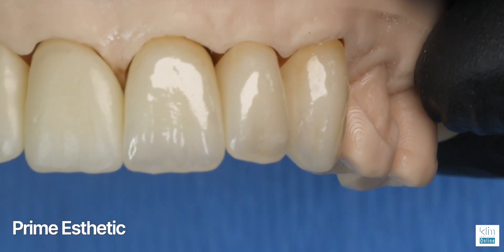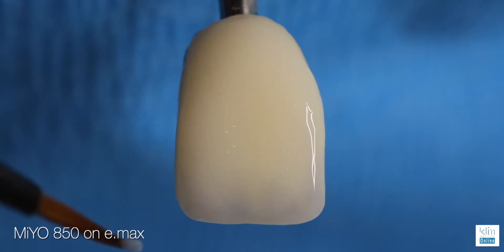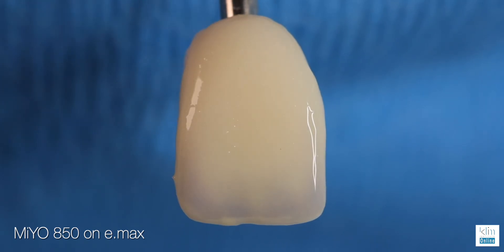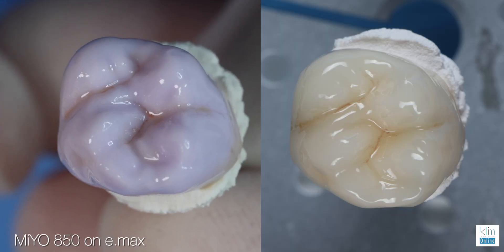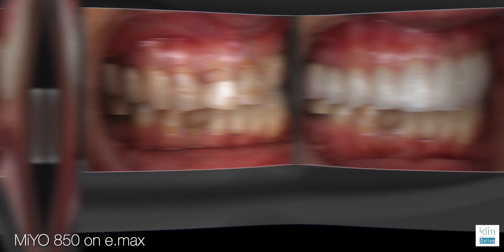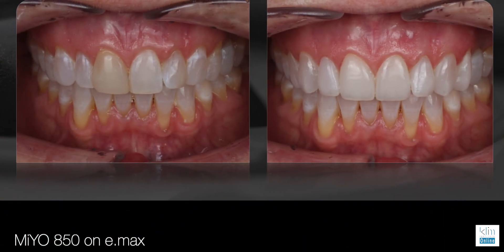The beauty of the colors on this is that they have translucency, and with that translucency it has more depth, which makes it look like you've stacked and layered it in. That's the beauty of Mio and their coloring system and accents — because you can create a very natural, depth-looking result with a brush-on ceramic on the outer surface, and that is huge in my clinical theater. What you see is what you get, and when it comes out of the furnace it is magical.